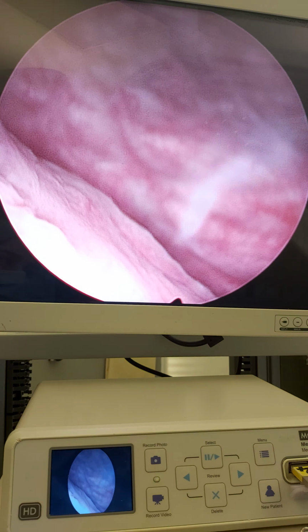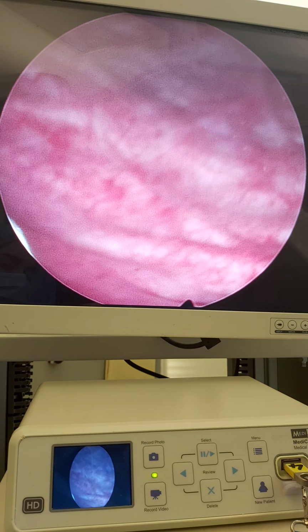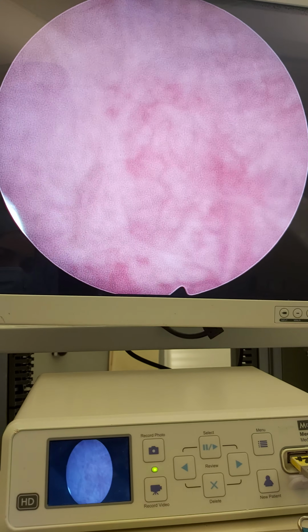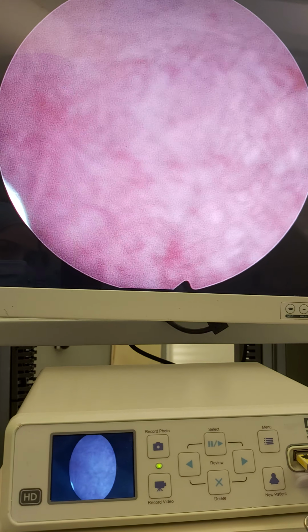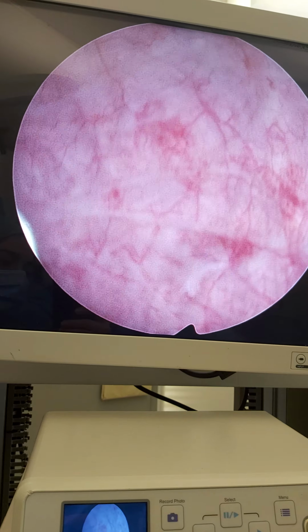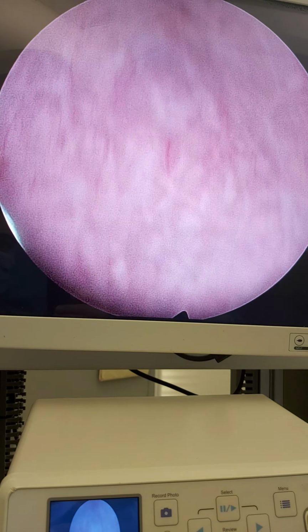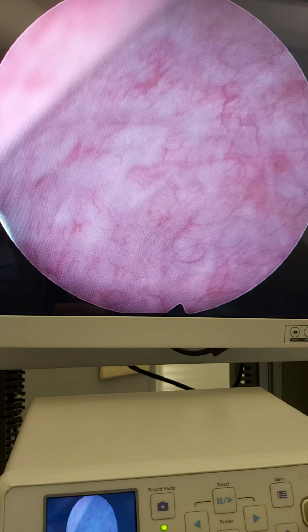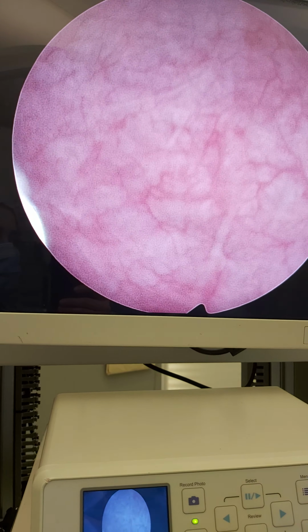And all these patchy areas, this is a more normal part of the bladder. When I look from a distance, you see these patchy areas, and in the opposite wall there's an inflamed area, and here we have some inflammations. Maybe we have some kind of embedded bacteria, some kind of biofilm covered bacteria. Okay, we will start now.